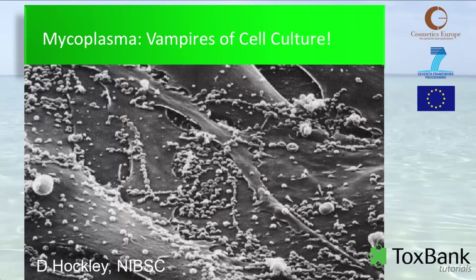In this picture you can see mycoplasma organisms covering the surface of a series of animal cells. This gives you an indication that these are very small organisms — they're one of the smallest bacteria known. They also often are closely associated with the cell membrane in cell cultures and through that are actually feeding on the cells, hence the name 'vampires of cell culture'.